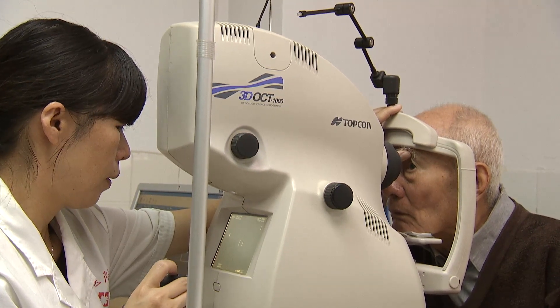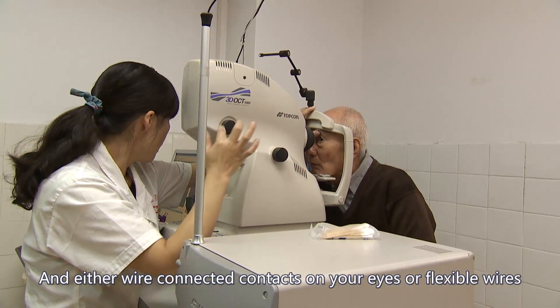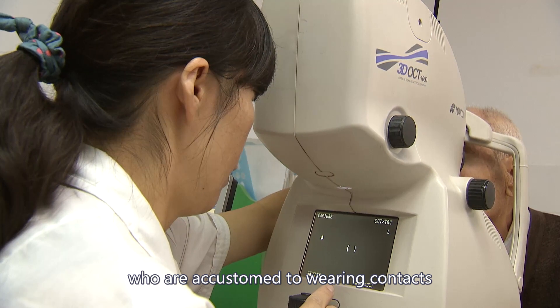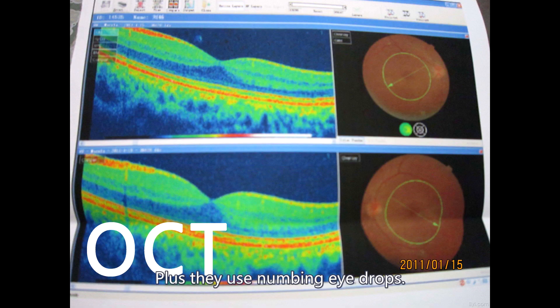They use sticker electrodes on your forehead and temples, and either wire-connected contacts on your eyes or flexible wires lying under your lower eyelid. Those who are accustomed to wearing contacts do not find this too uncomfortable, plus they use numbing eye drops.